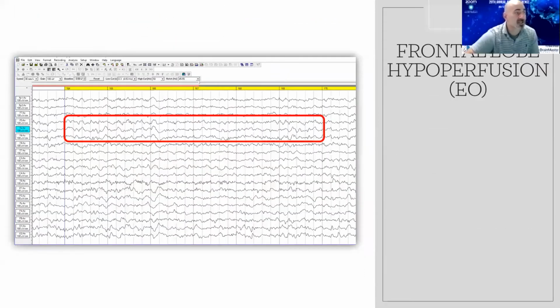Here's what this looks like in the EEG. And you can see here that there's these waves. If each one of these boxes is a fifth of a second, boom, boom, boom, boom, boom. And here there's some more of this. And if we looked at this client's full 10-minute recording, you see that this generally persisted throughout the bulk of the recording.